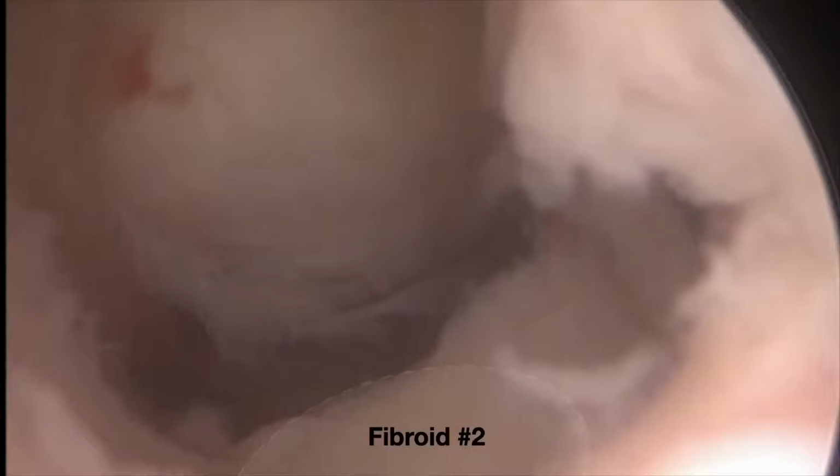As you can observe, fibroids are enucleated but not completely released from the fibroid fovea, hoping that they will not be moving loosely and can be easily grasped once their extraction is attempted. Fibroid number 2 in the posterior corporeal wall is enucleated. Adjacent healthy myometrial tissue is kept intact without any thermal-related injury. Its anatomic and functional integrity is preserved, which is of crucial importance for fertility patients.